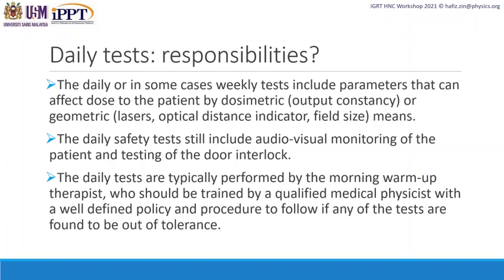It also includes audio-visual monitoring of the patient and also the interlocks. And usually it is performed during the morning warm-up of the linac and performed by the therapist. So the therapist and the medical physicist should have a well-defined policy and procedure to follow if any of the tests are found to be out of tolerance.